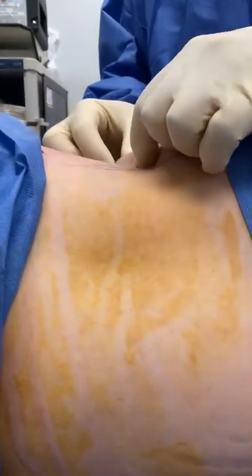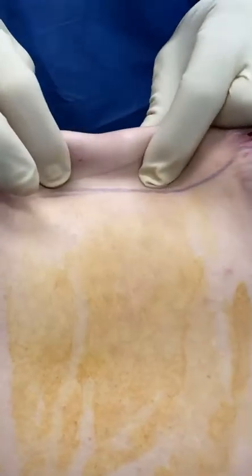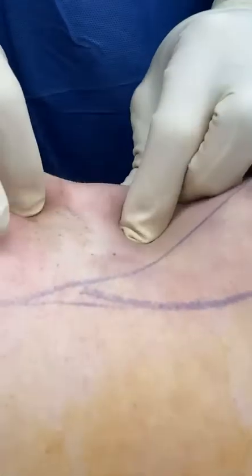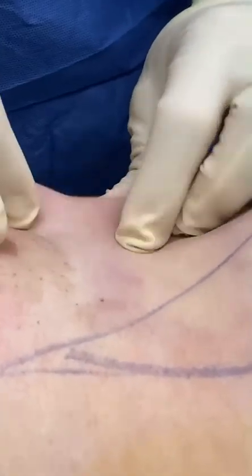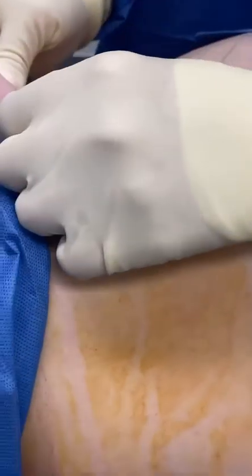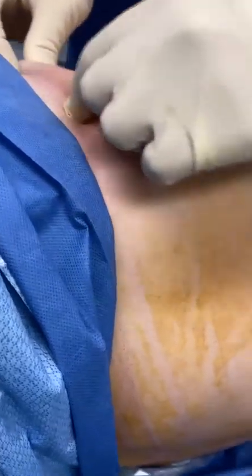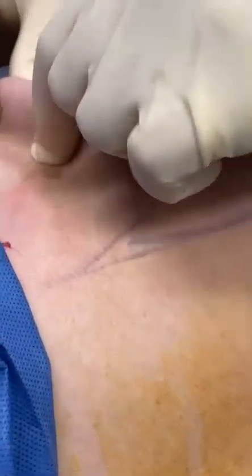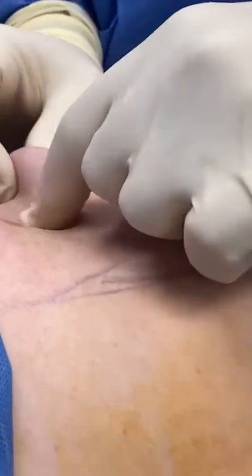So this is what we call the pinch test. You can see how there is absolutely no excess fat here anywhere we pinch. Here at the Cosmetic Surgery Center of Posterito, you can also run it like this — see how there is no excess fat anywhere we go.